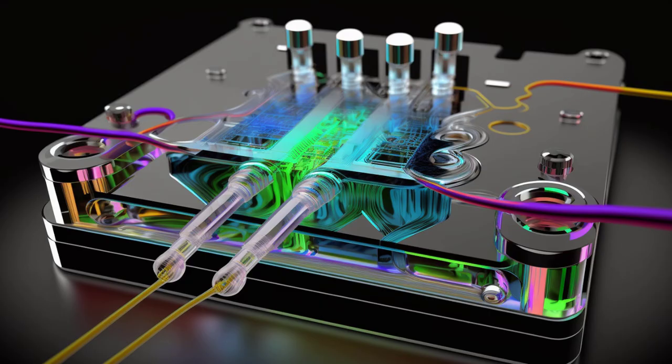Uniform microbubbles provide consistent acoustic signals, leading to clearer and more reproducible ultrasound images. Imagine a high-tech assembly line where every product is made to the exact same specification. This is the advantage of microfluidics in creating reliable microbubbles.